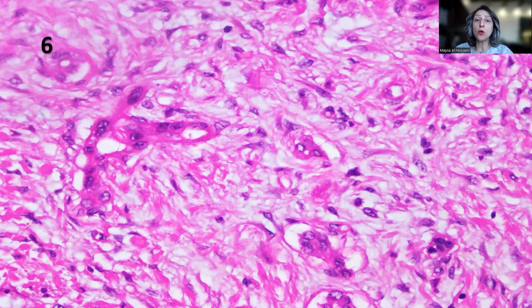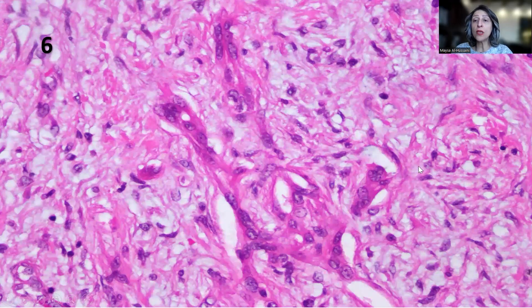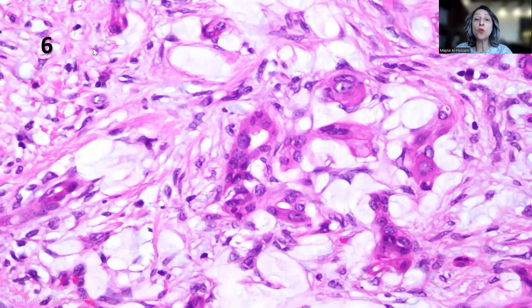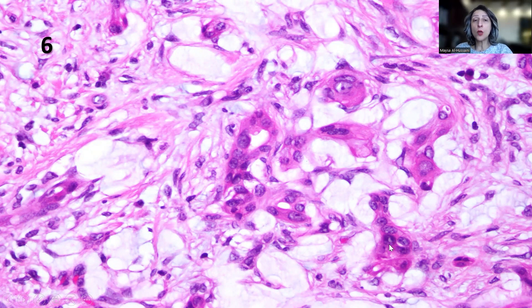One of the foci of the colloid carcinoma shows the growth of small glands with marked atypia growing in a very prominent desmoplastic stroma. Another separate focus shows almost the same appearance, but here we start to see more mucin in the background. Those small, highly atypical glands with even more mucin in the background support the diagnosis of colloid carcinoma.